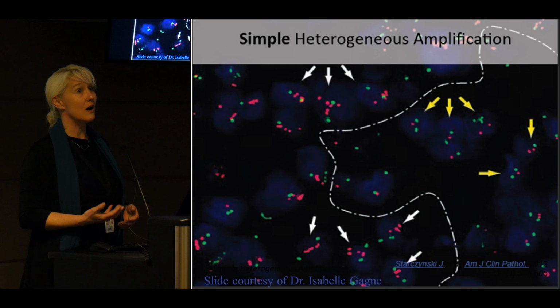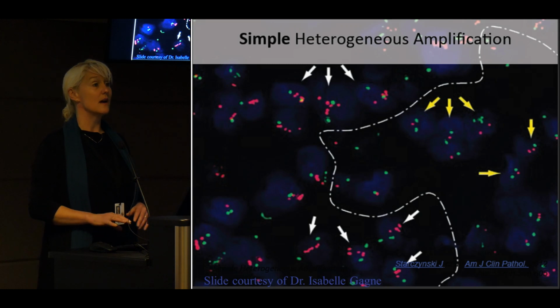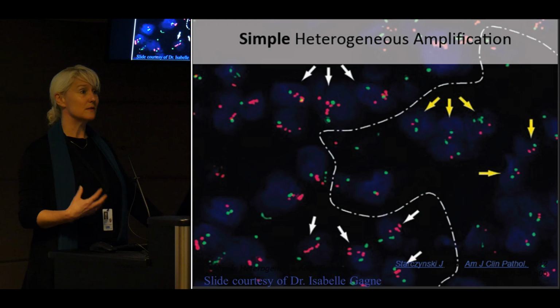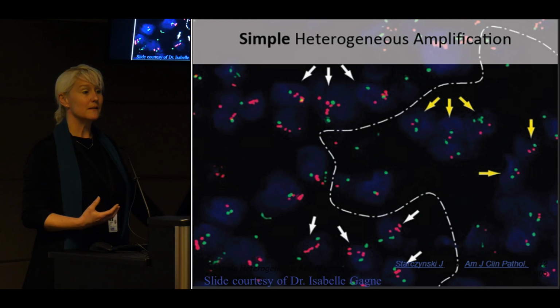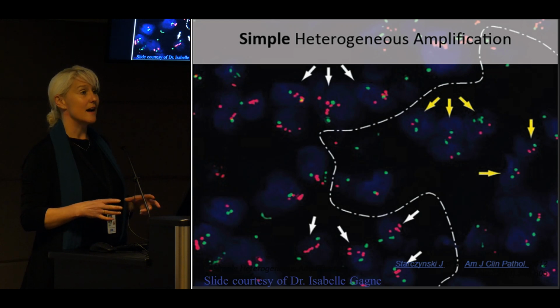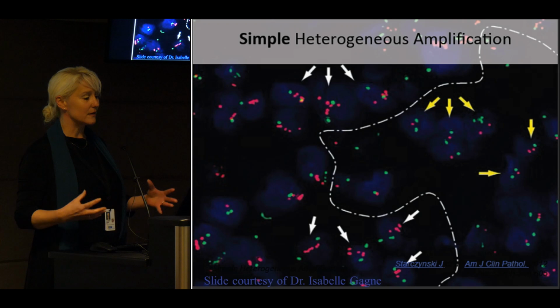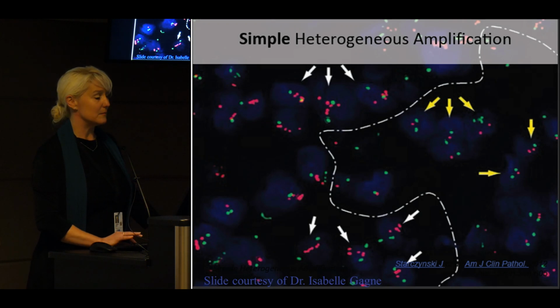Pathology, like all of pathology, or a lot of it, is based on in situ analysis. So fluorescence in situ hybridization allows you to detect the abnormalities within their context. And yesterday, Melanie was talking about microenvironments and these large sections that they can take in order to look at the big picture. And in certain abnormalities or certain cancers, it's really important to look at the big picture. This happens within certain tumors with genetic abnormalities. You can see subclones and heterogeneity. So FISH is very valuable.